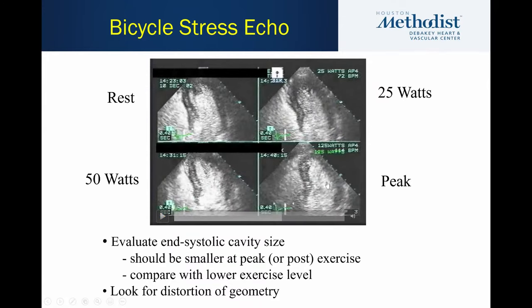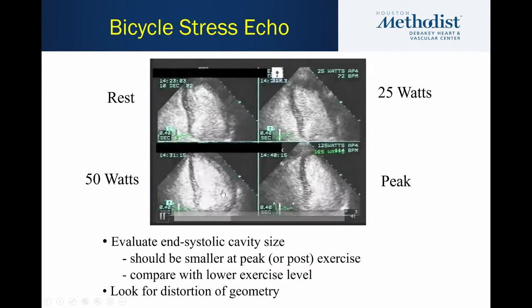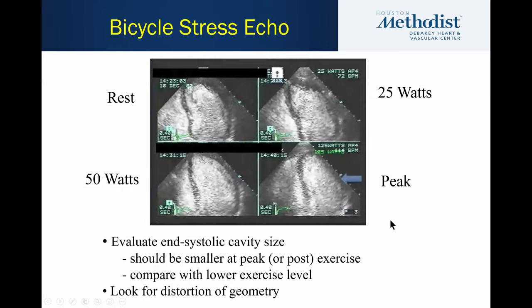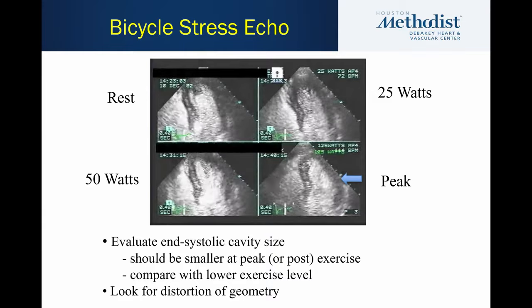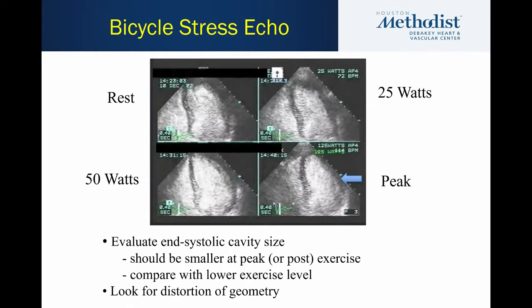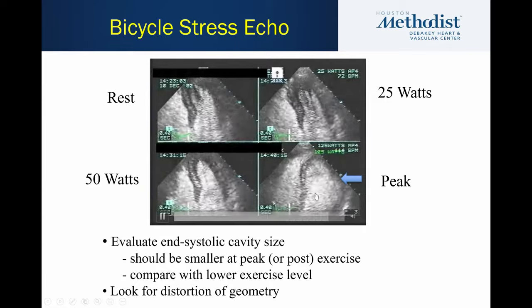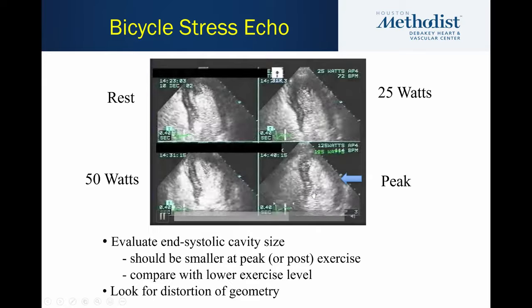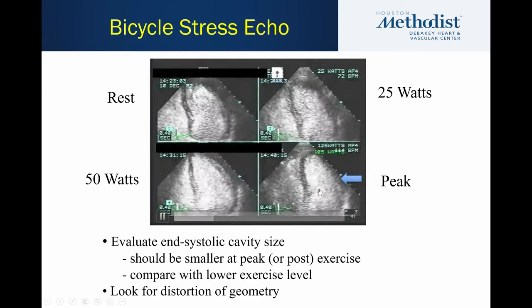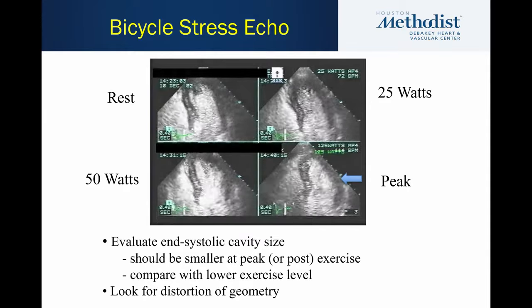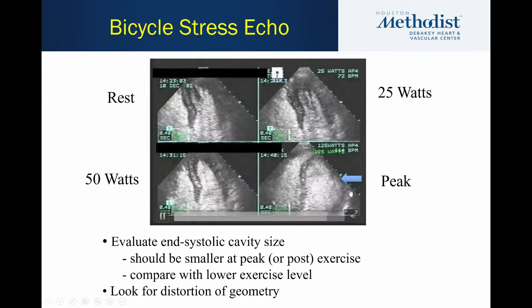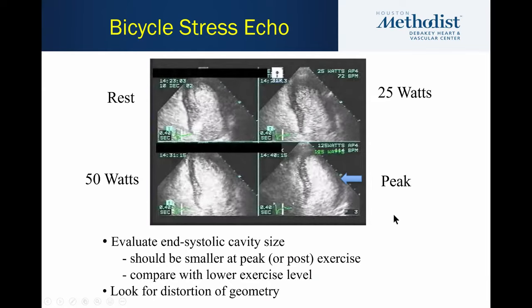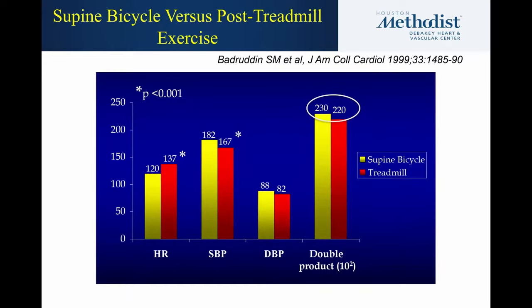In this four-chamber view at rest, there's a normal EF that actually gets better at 25 watts and better still at 50 watts — the increasing function you'd expect with exercise. But then at peak, you can see regional dilation particularly in one region. Looking at the wall motion, the septum is doing okay and it's really the lateral wall that is having the problem — a case of significant ischemia in a patient with a large OM-circumflex type lesion.